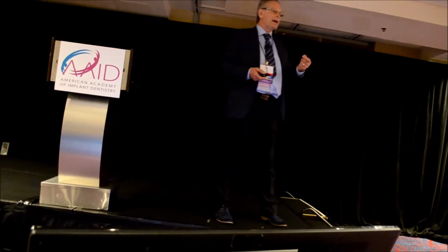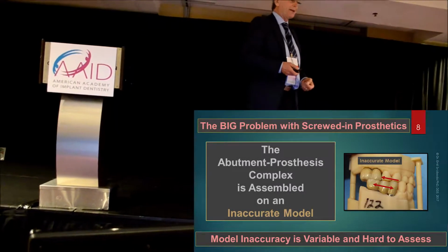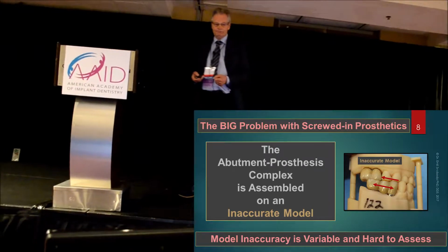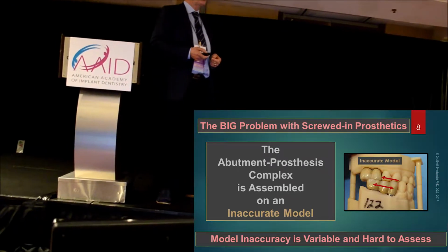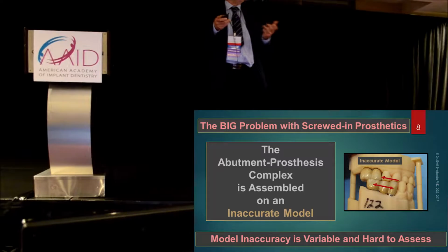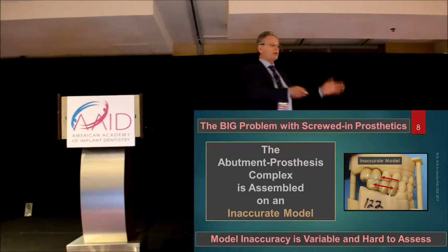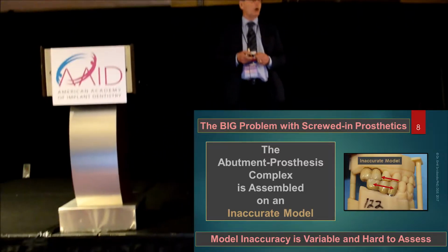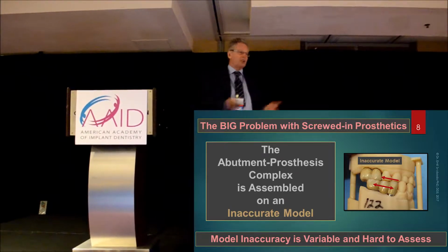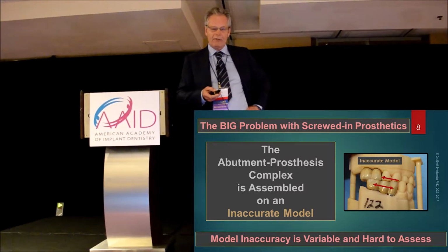The dentist can't assess the accuracy of the model, and every single model is inaccurate. That's the problem. Some are just more inaccurate than others. And it doesn't matter. I've been working with digital impressions for a while. You know, you have particle sizes, you have implant analogs that you've got to shove into these printed models and all these sort of things. Both systems have inaccuracies, and I'm not even sure which one's more accurate than the other. I think the digital is actually catching up to the analog in this field yet. In the future, maybe it'll be different.